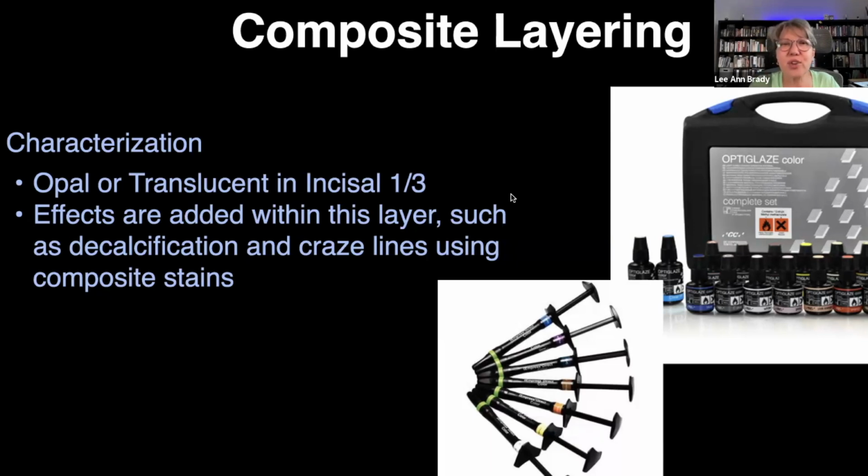They come in different viscosities. If they're very low viscosity, you layer them and you keep adding layer to make the color more intense. If they're higher viscosity, you actually dilute these with your dentin adhesive or with a clear. The systems come with a clear you can use to dilute.